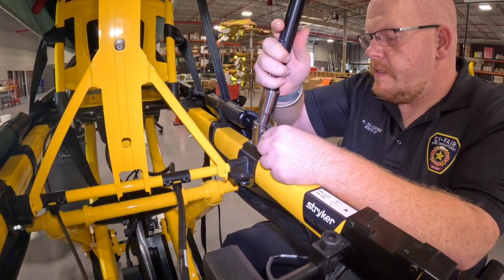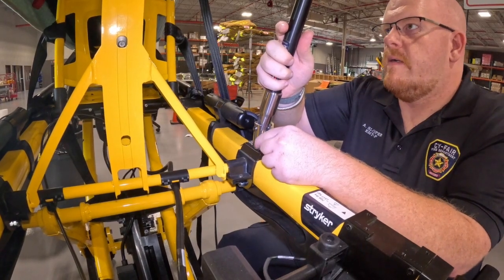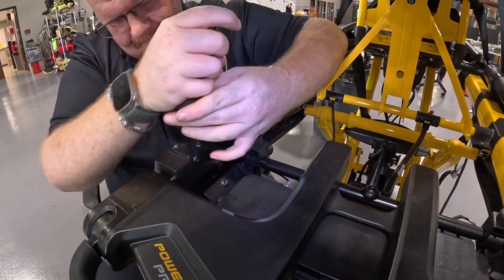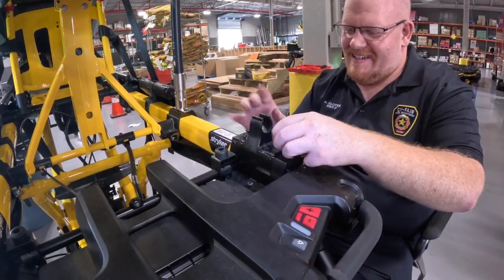Please make sure the orientation of the IV pole is correct, such that the IV pole lays down towards the foot end of the stretcher. Next, take the IV pole clip out — four T30 bolts come out. Go to the opposite side and bolt back in.